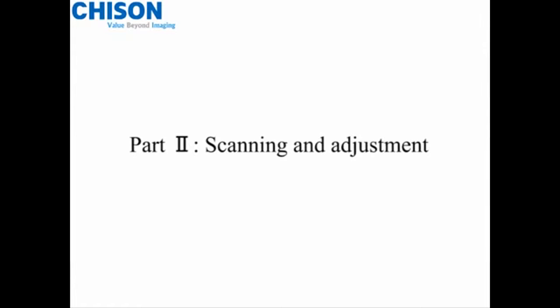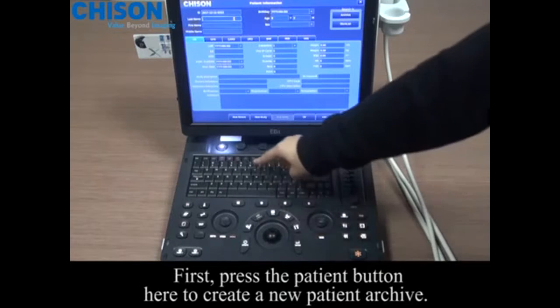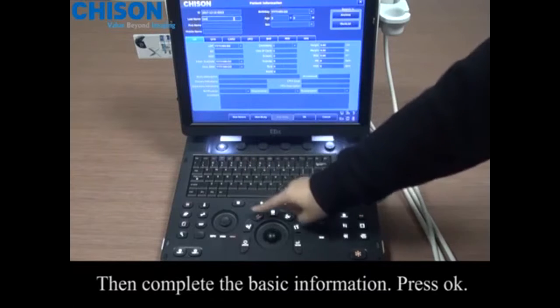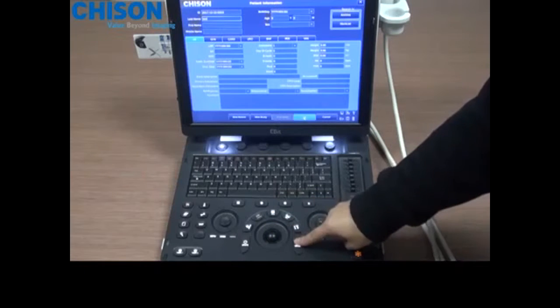Part 2. Scanning and adjustment. First, press the patient button here to create a new patient archive. Then complete the basic information. Press OK.